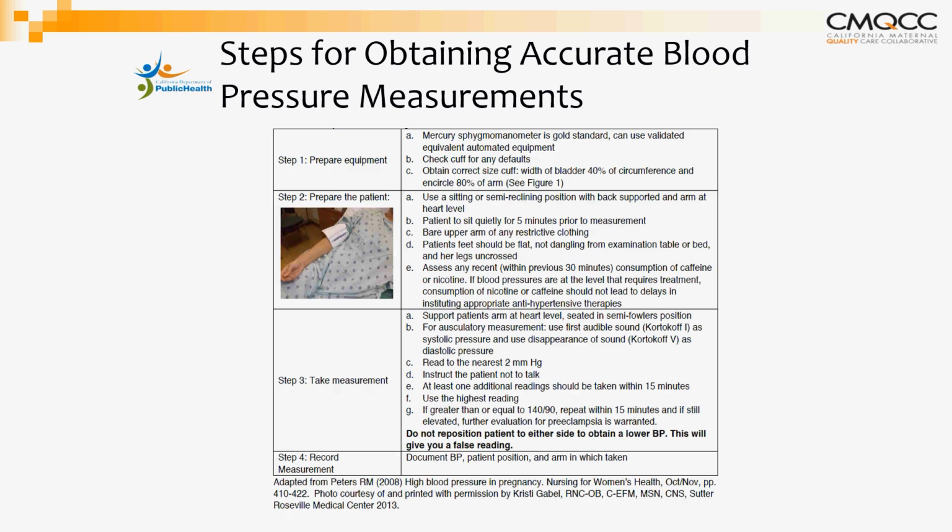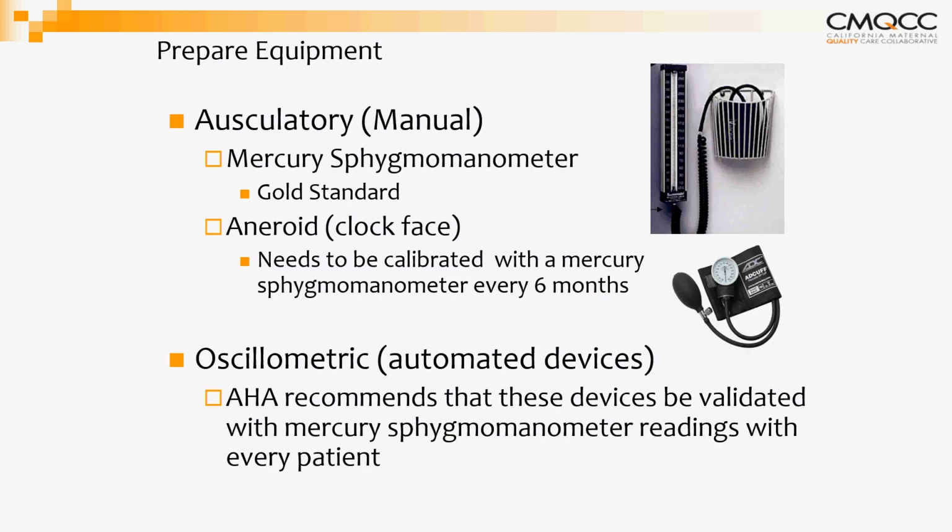We've all seen, some of us may also be guilty of putting the patient in a position or taking the blood pressure on the lower arm to get a lower reading, but of course that's not best practice, and it's also not going to help with accurate management, and may also miss something that could result in a severe range blood pressure or hypertensive crisis. Next slide, please.